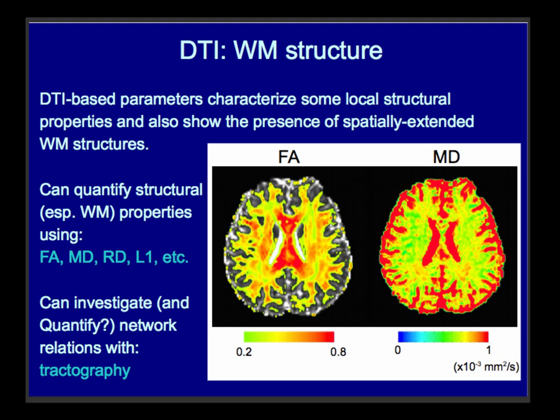With white matter structures, we have different ways of probing it. And we also have the same idea where we want to say, okay, if this little bit of the brain, this kind of voxel, what are some properties of it? So these local properties. And we do that with these kind of inscrutable sets of letters, but we'll talk about what they are a little bit.